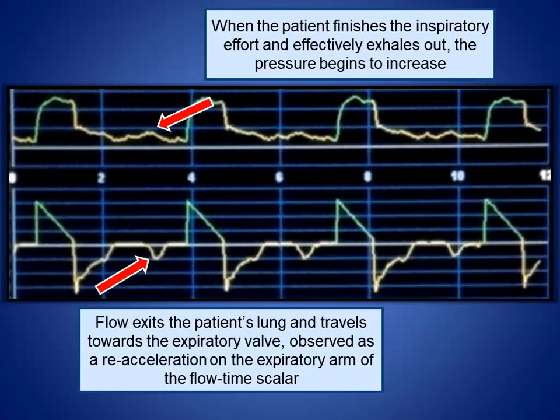And this is the telltale sign. I often like to say that if you ever want to really understand what's happening with your patient, look at the expiratory flow, because you don't control that. That is completely passive, and that's when your patient is essentially telling you what's going on with them. They're talking to you at that point. You control much of the inspiratory breath across all the modes.